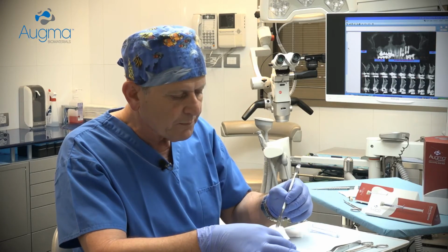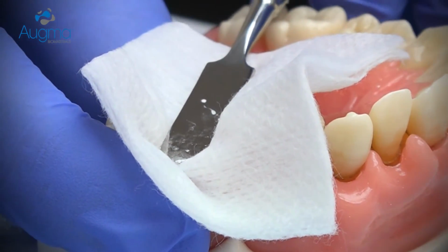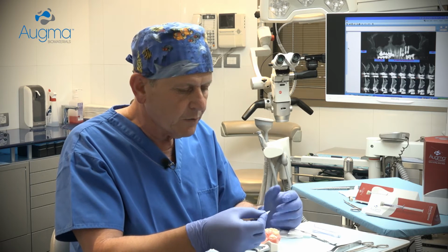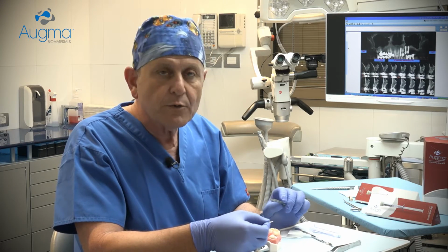And now you take a dry gauze and press firmly the material into the socket. Now, if there is not enough place for your finger between the teeth, use a spatula or an elevator and press above the dry gauze. Now, you cannot leave the material exposed. What you need to do is to take a barrier, which can be a simple collagen sponge, and place it above the graft. However, it must be sutured together with the soft tissue.